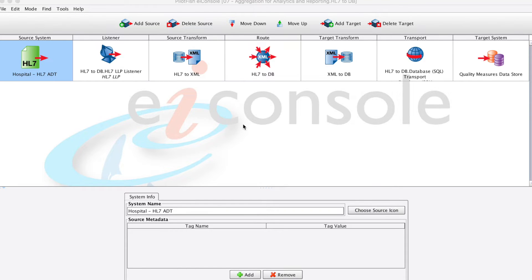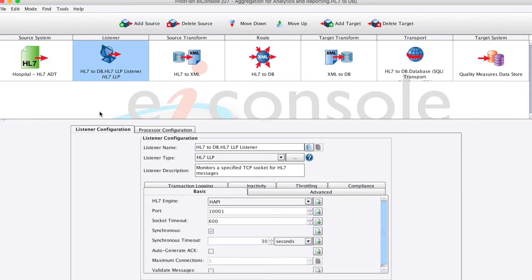We begin in the main route grid that depicts the flow of data between our source system, a hospital, and our target system, an external database.